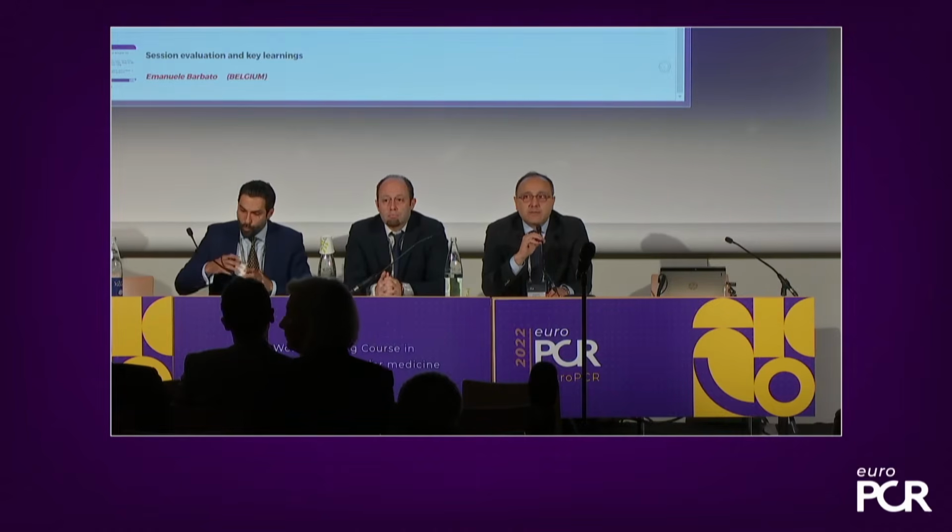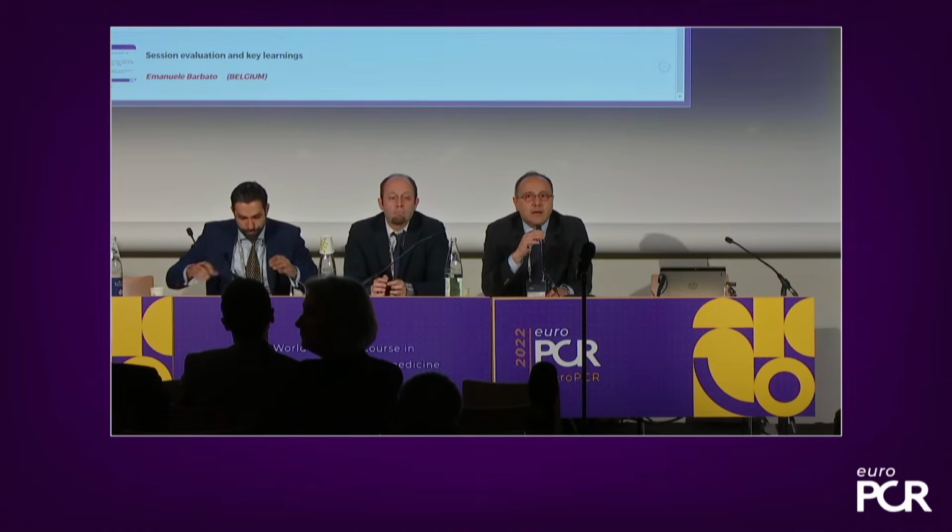By show of hands, I'd like to ask you, how many of you in the room, when assessing physiology, would rather do single point measurement, just pressure wire down, and you measure resting index, hyperemic index, and how many of you do on top of this also a pressure pullback? So let's start stepwise. How many of you do single point physiology measurements?